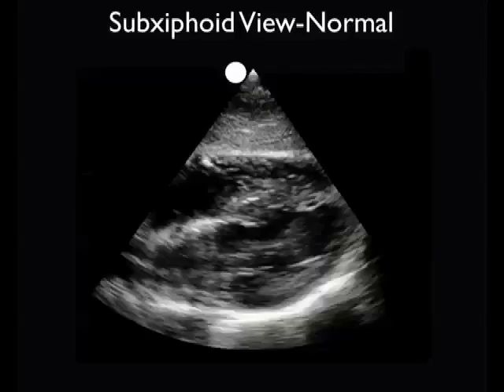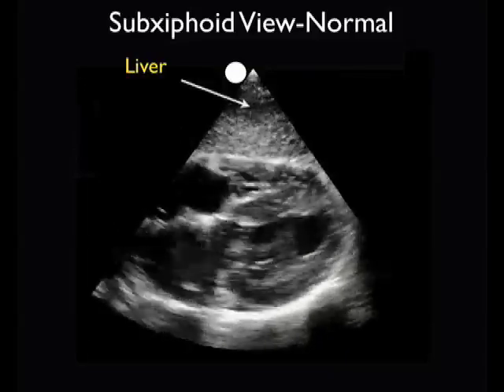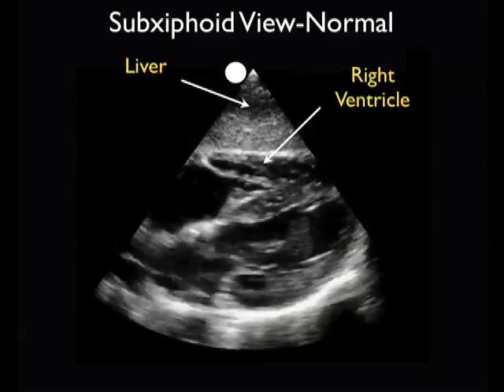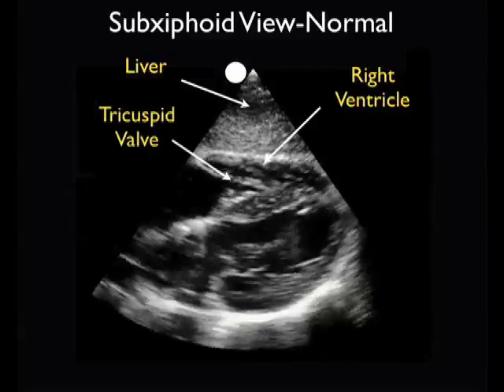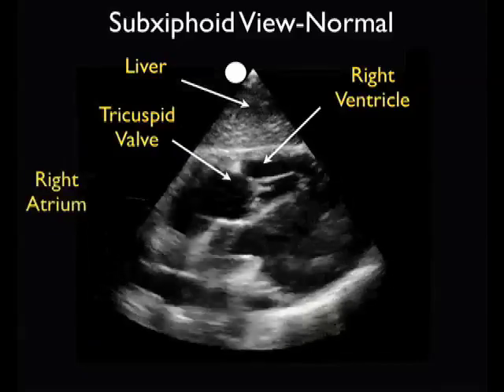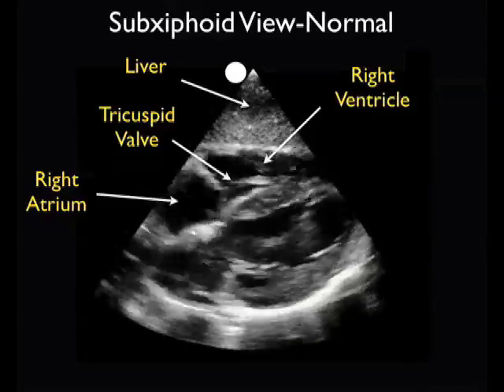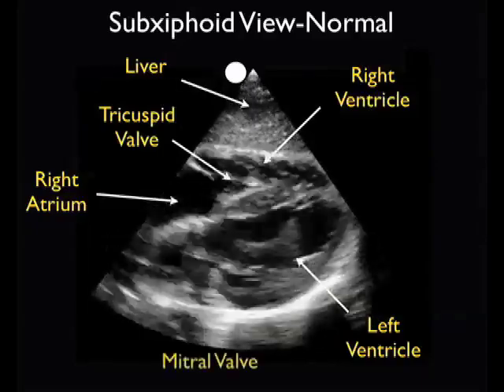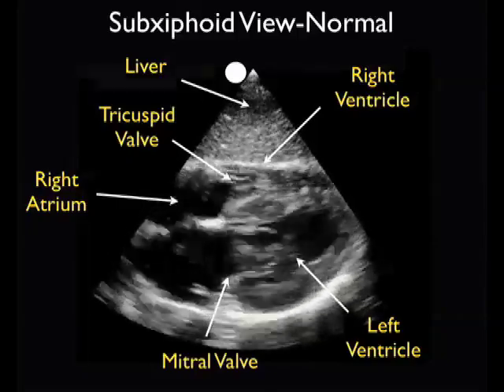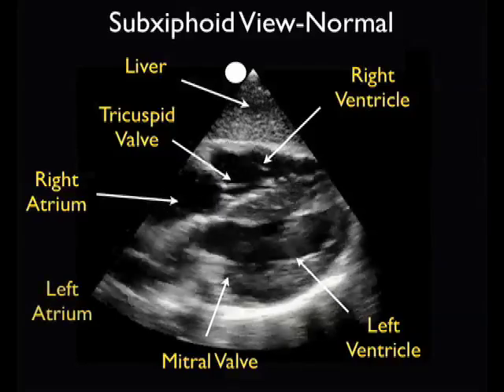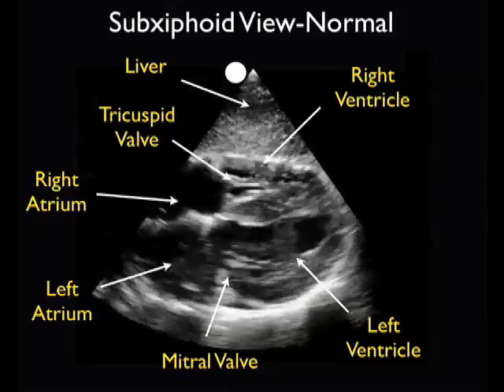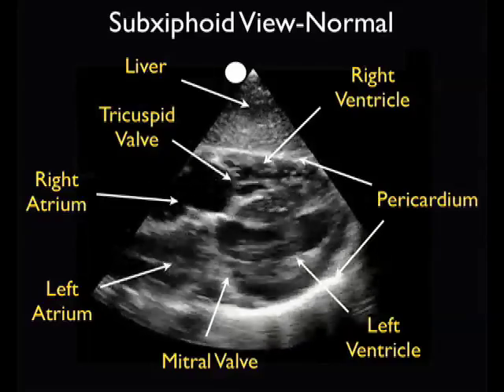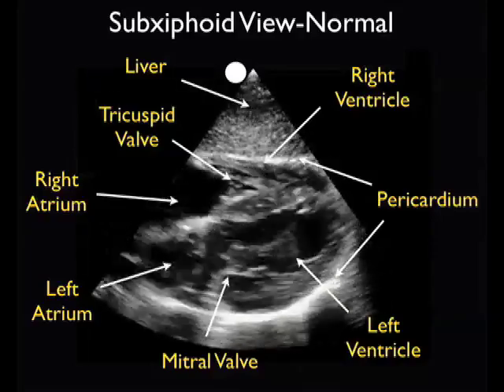Now let's look at a video clip of a normal heart from the subxiphoid plane. The liver is our acoustic window and is seen anteriorly at the top of the screen. Just below the liver we appreciate the right ventricle, and just to its left the right atrium. Notice the tricuspid valve flipping up and down between the right atrium and right ventricle. Posterior to the right ventricle is the more muscular left ventricle, and to its left the left atrium, with the mitral valve visible flipping between them. Note the white pericardial line both anteriorly above the right ventricle and posteriorly below the left ventricle, with no significant pericardial effusion present.